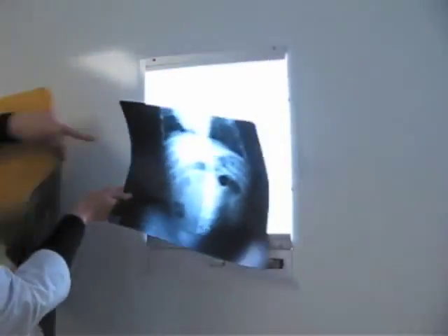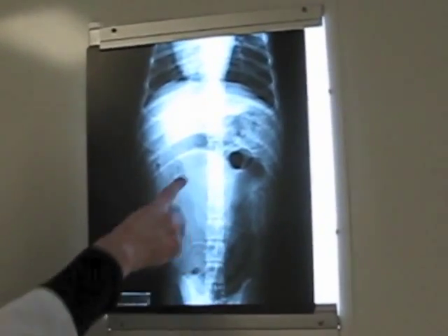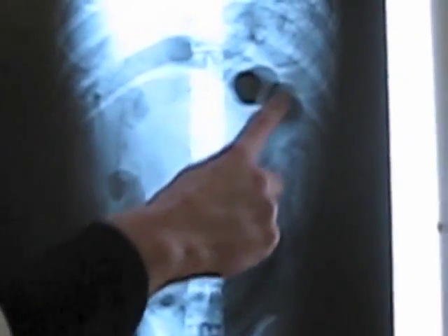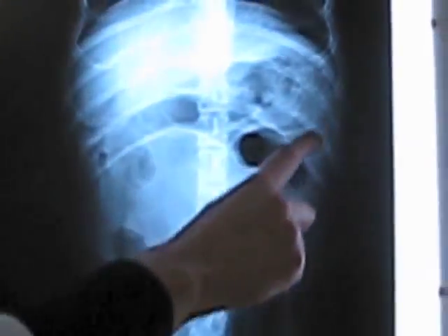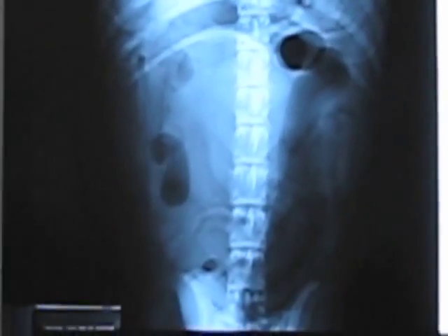Take a picture of him laying on his back too, and you can maybe see it a little bit better here — how there's just this whole area in the middle where there's no intestines. They're all getting pushed down here. Gas in the x-ray is black, so this is just gas in his colon. That's food in his stomach. A little edge of the spleen here, but there's just this area where there's nothing in the middle, and that's what makes us think that we might have a splenic tumor.